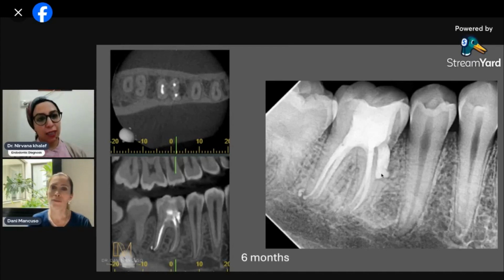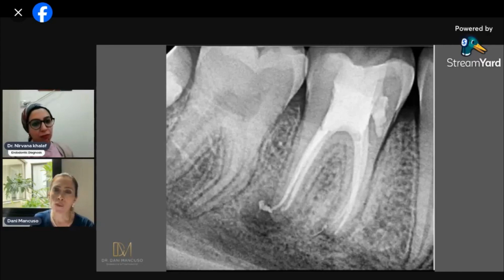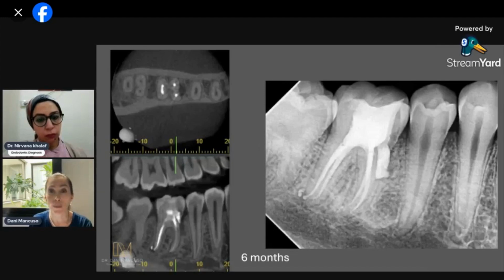It was not easy to fill this cavity. The first attempt we tried, it was difficult already. The second attempt was a lot better because in the first attempt I had dried that area completely, so it was not that mucky inside. That's why we decided to try again.